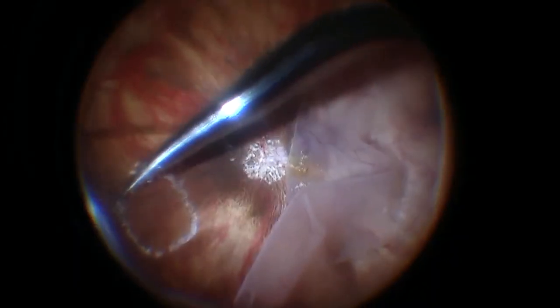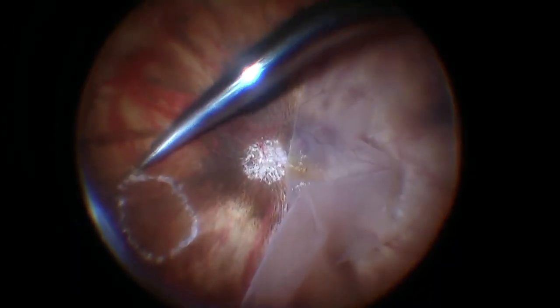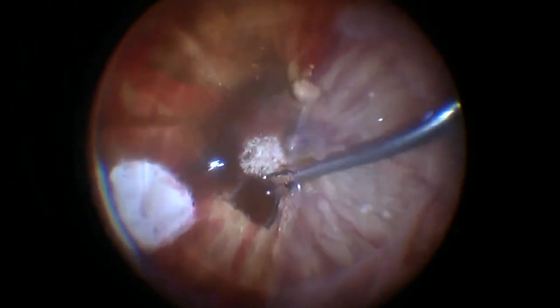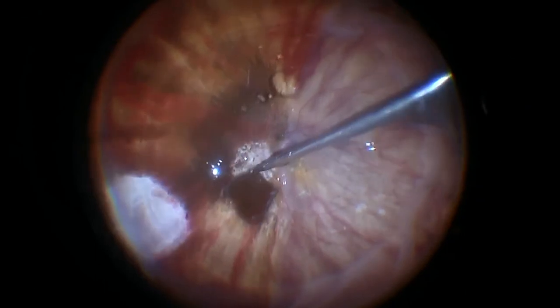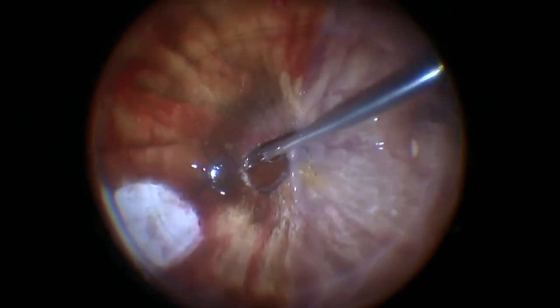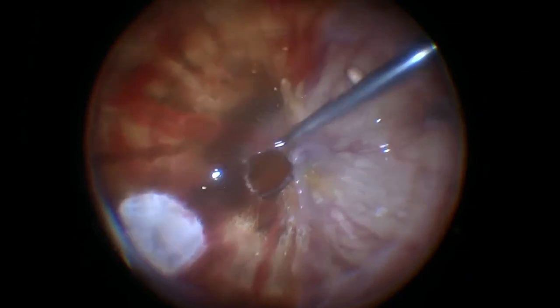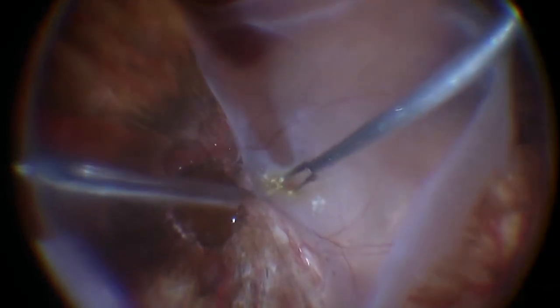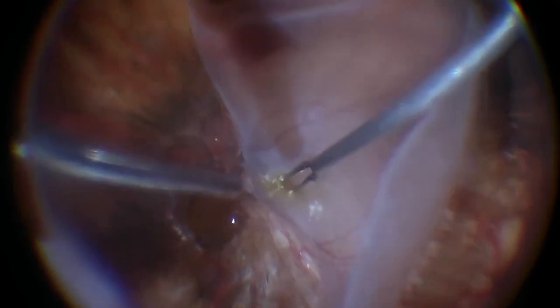This is the removal of CNV, the isolation of the choroidal patch. The patch is transplanted under the fovea. This is RPE and choroid, full thickness. And then you will see that I observe the presence of the macular hole.